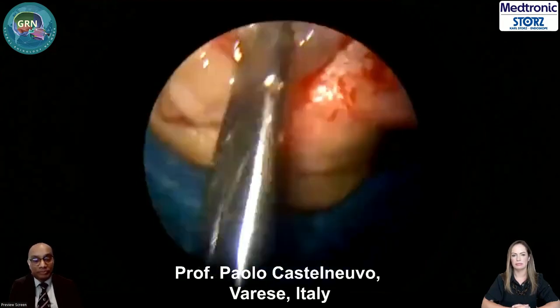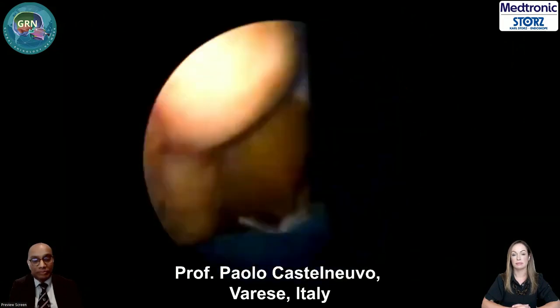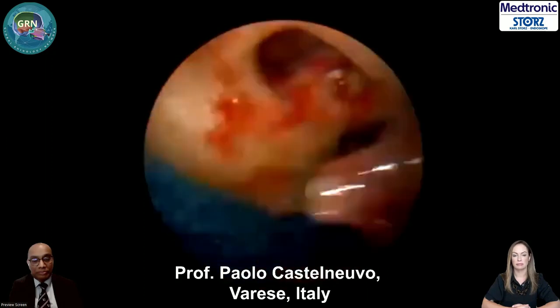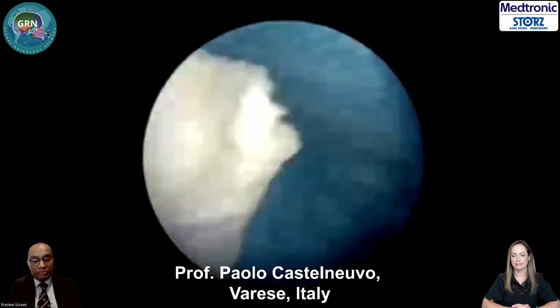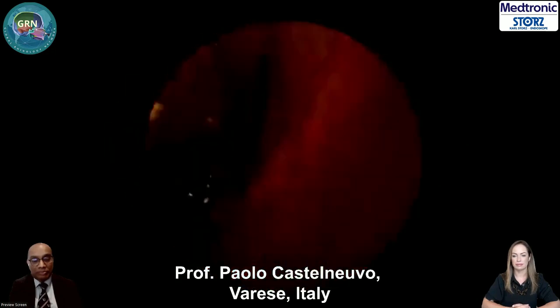So I am removing the inverted papilloma that was in the middle meatus and in nasal fossa, and we send for pathology.